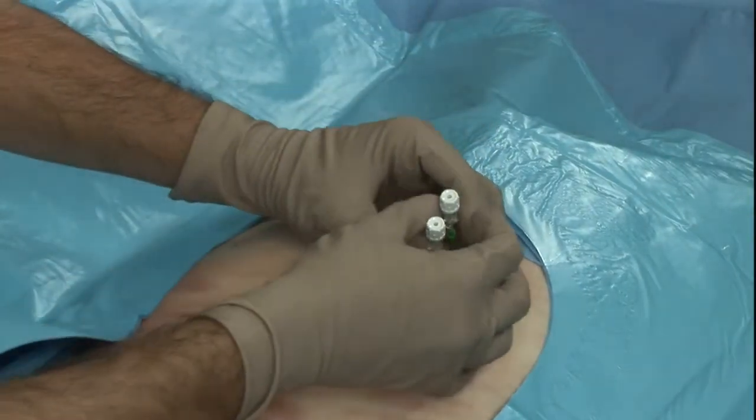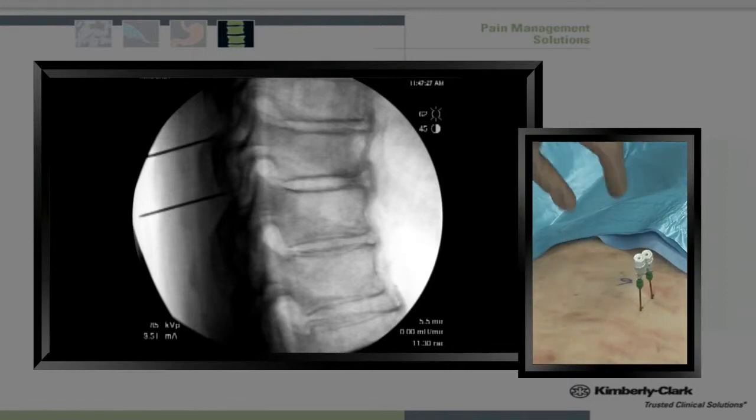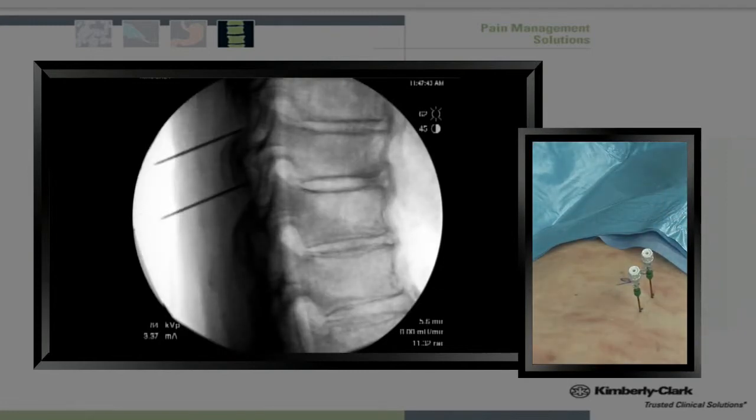And as you can see here, we're not too far deep and we're right at the level of the transverse processes. At this point, I typically walk my needle up slightly so that I'm, again, remaining on the transverse process, but have gotten into a space that will allow me to capture the medial branch with my lesion.